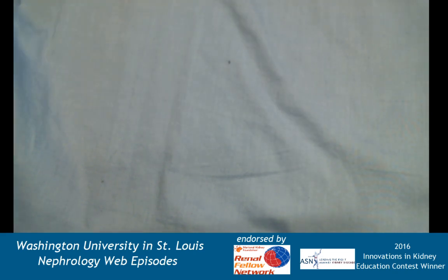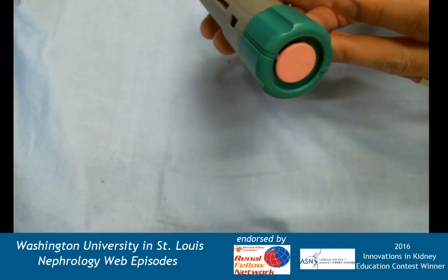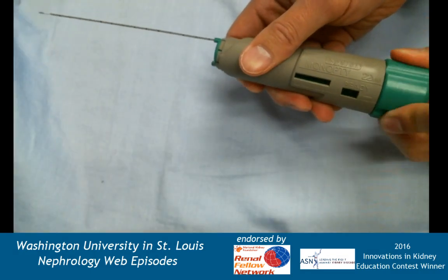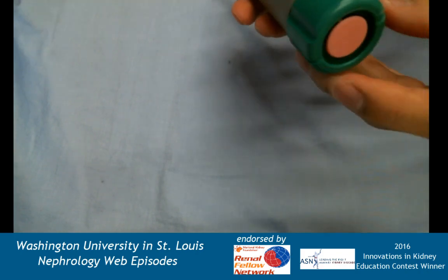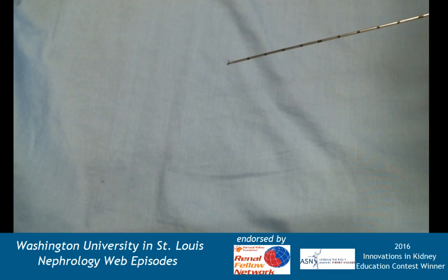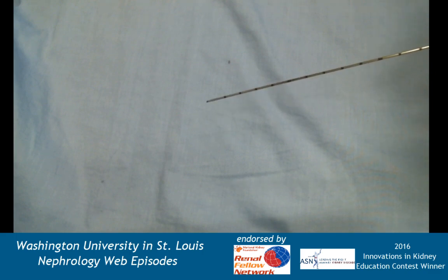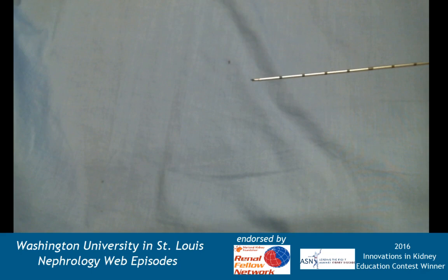Modern devices — this is just one example made by a company called Bard. This is a spring-loaded device; the trigger is on the end piece and the whole mechanism is cocked by turning. As I fire the trigger, both the inner shelf and the outer cutting edge go forward — the inner edge goes out first, then the outer cutting sheath follows. When I turn clockwise it pulls back the outer sheath, revealing the core of tissue on the inside, which you would then place onto a slide.